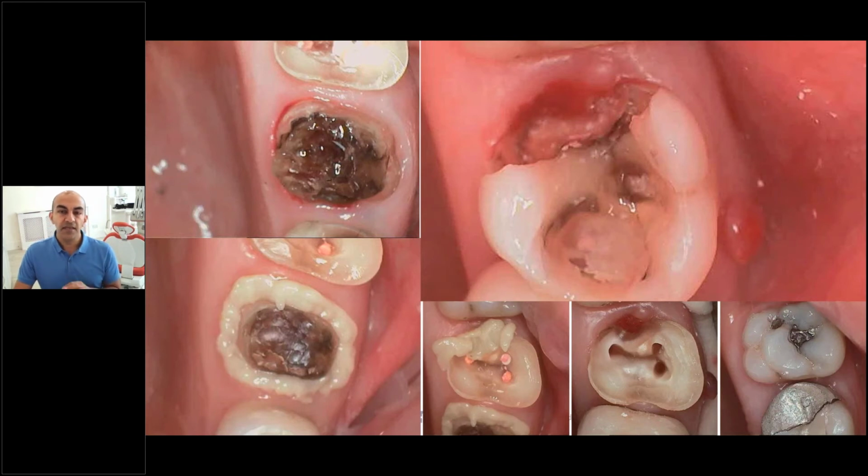So here you can see I am really trying to highlight different methods of tissue retraction. People are often worried about doing subgingival margins with digital, especially deep margins. Well, the top right-hand image, that is a preparation that is 3 millimeter subgingival. Now, the bottom middle image, you can see exactly the same tooth preparation, and you can see that with various techniques, whether it be chemical or physical or laser, we can manage soft tissue, and therefore, if we can manage it, we can usually image it.